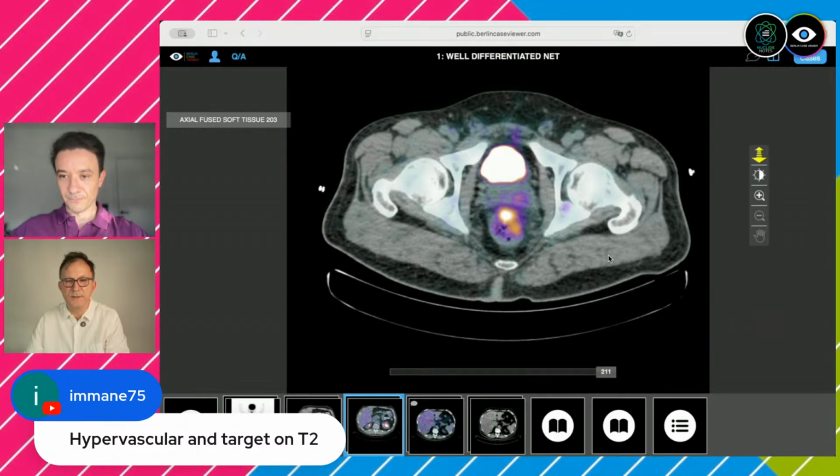Okay, and this question that is on the stream now, hypervascular on target, I don't really know how to better word it. Maybe you write the question again. What do you mean, Imane? I think on MR, if you do a contrast enhanced MR or contrast enhanced CT, yeah, they should light up. They should show diffuse enhancement.